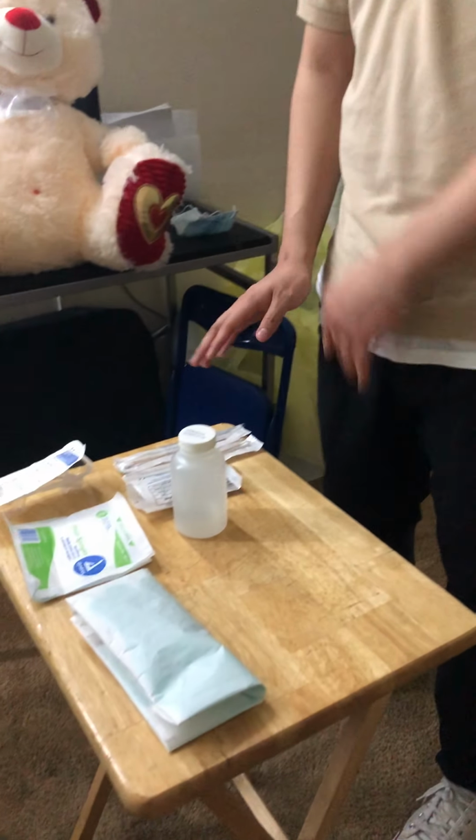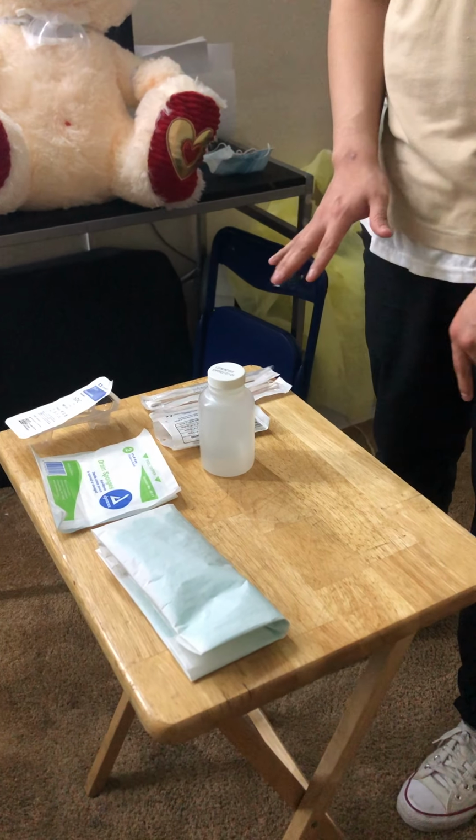I'm an N3 student, and today I'm going to be performing tracheostomy care. With tracheostomy care, I do want to say I want to have my sterile field. I want to sanitize it before I put my equipment on there. Sanitize it for 30 seconds, 45 seconds, depending on the sanitizer. Let it air dry for the appropriate amount of time.